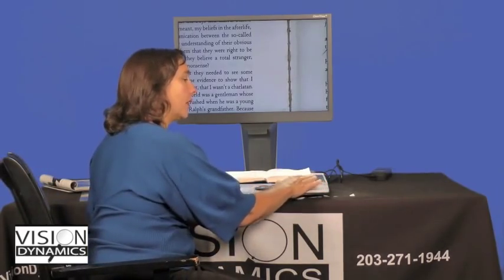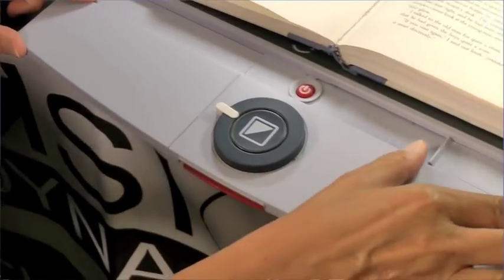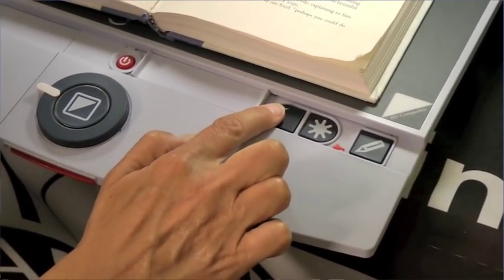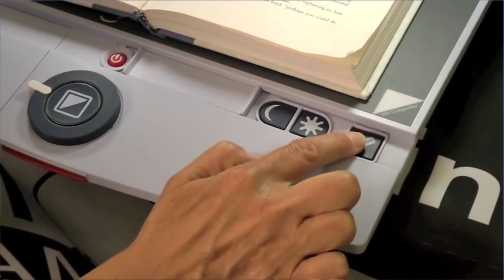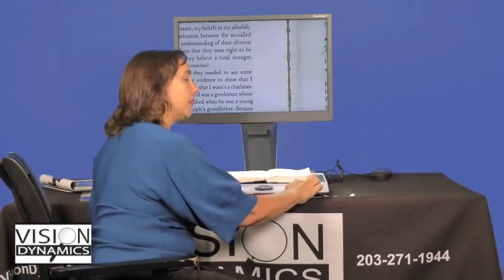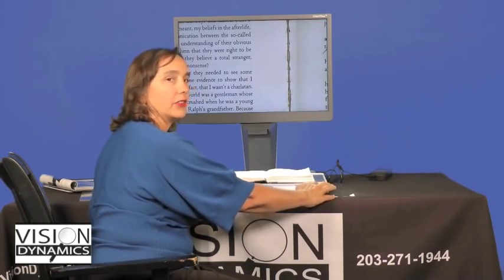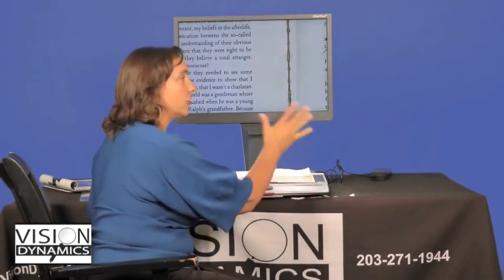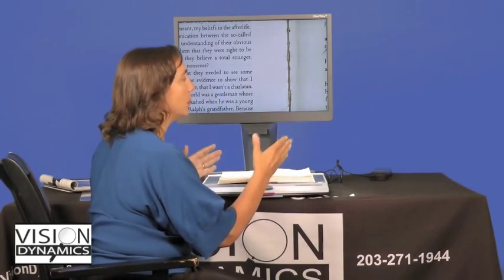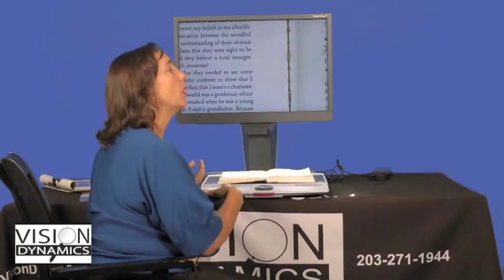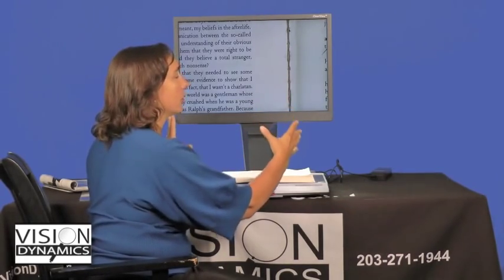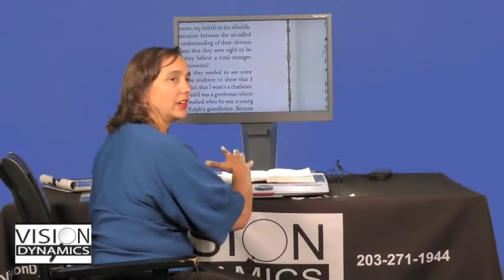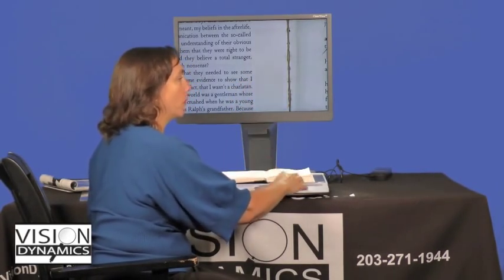Okay, and now on the tray, up to the top right-hand corner, there's a panel that you can slide to the left that covers a series of three buttons. And those three buttons, one has a moon on it, the next one has a sun, and the third one all the way to the right has a pencil on it. The first two, the moon and the sun, affect the shading. So we're in color mode right now, but maybe you're going to get a lot of sunlight in a room or something like that where it's going to affect what you're seeing on the screen. So you can adjust the shading on it while still staying in color mode or black on white or white on black.